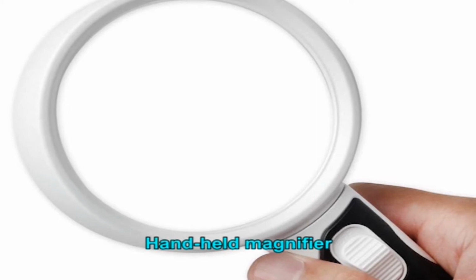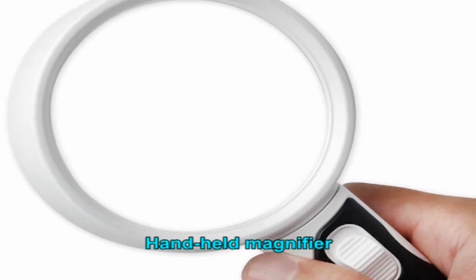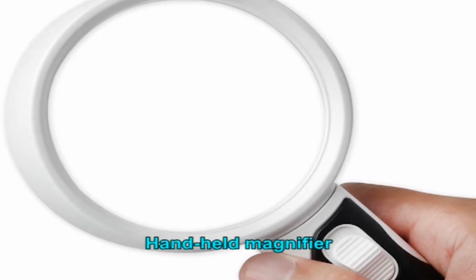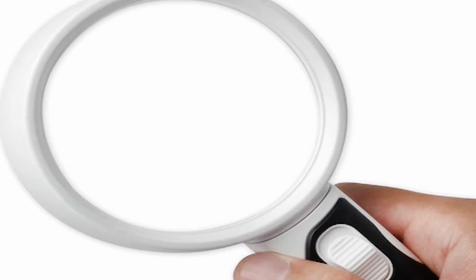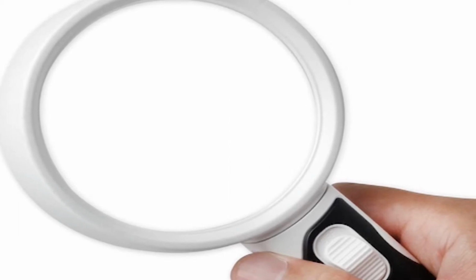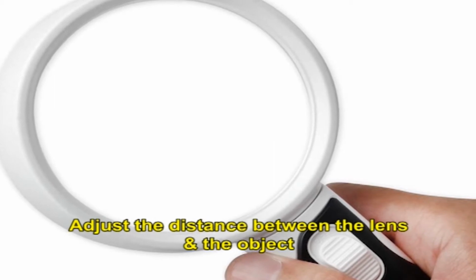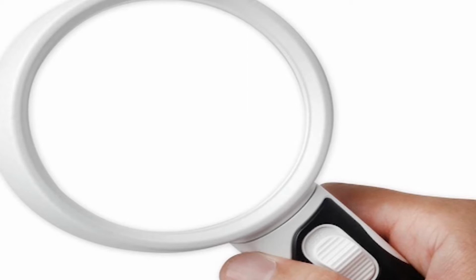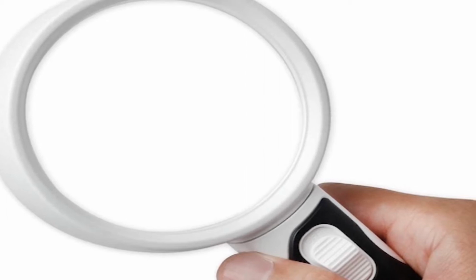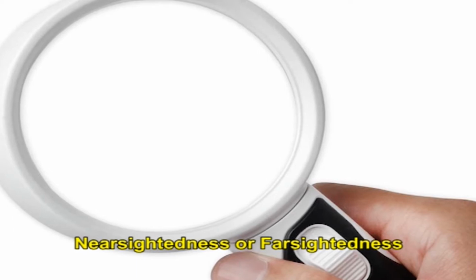Handheld magnifiers. The handheld magnifier design involves a handle that is attached to a lens through which the user will view an object, whether it is text or an image. Because the user has the ability to adjust the distance between the lens and the object, handheld magnifiers can be used to easily compensate for slight differences in uncorrected nearsightedness or farsightedness.